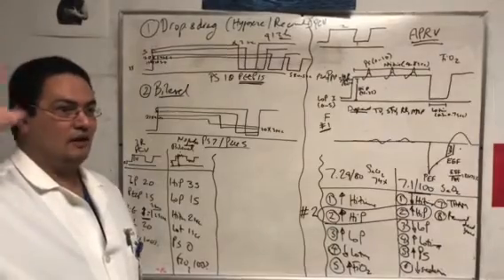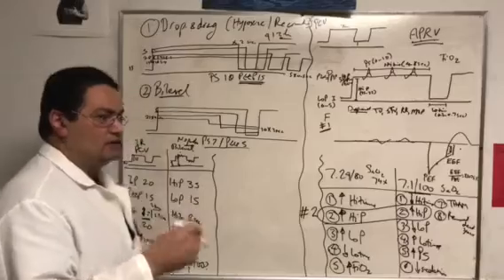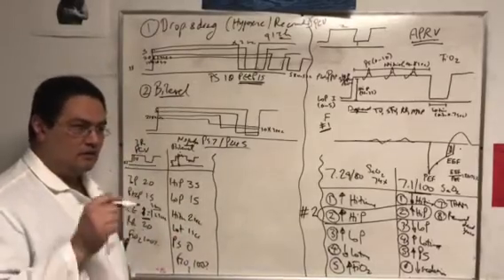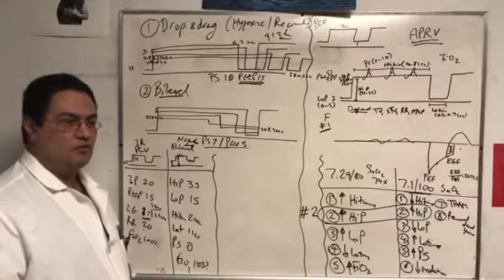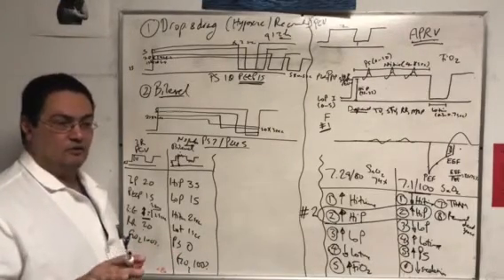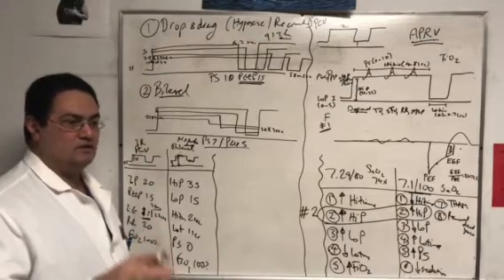So we made a lie. We lied to everybody, and we said that you cannot have bilevel unless the 2 times are equal. So that's the rule. I abide by it all the time. No bilevel is done unless the 2 times are equal.